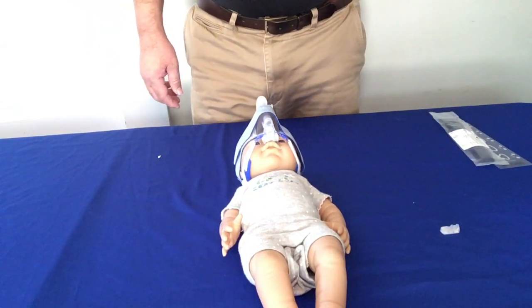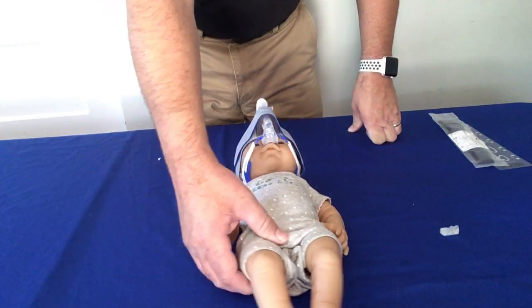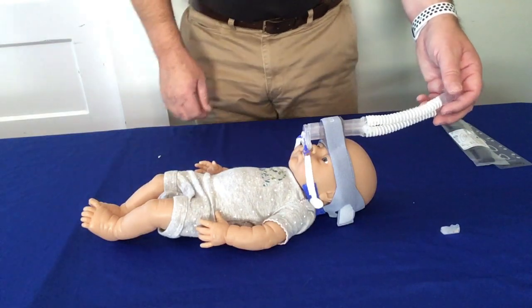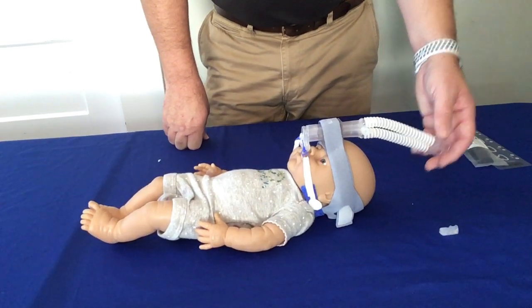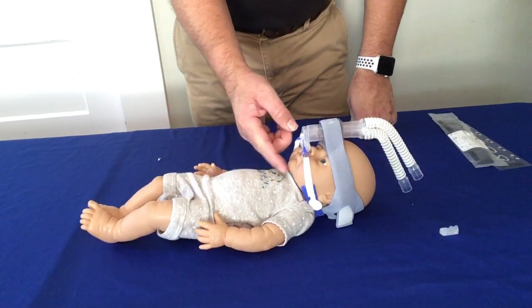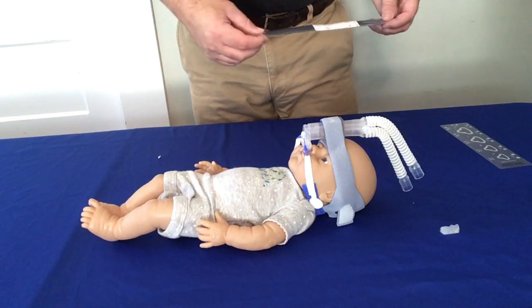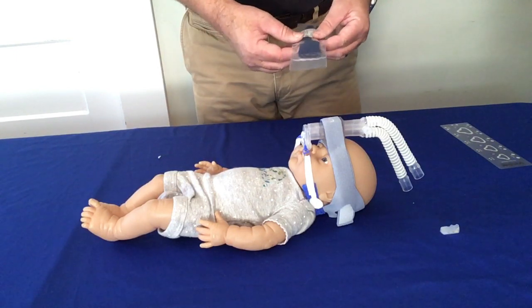If your baby needs a chin strap, it's very easy to determine. The way you do that is if the baby is hooked up to a ventilator or a bubble CPAP and you are getting a lack of pressure reading on either system, whether it's the ventilator or a lack of bubbles in your bubble CPAP, what you'd need to do is go ahead and take your finger and place it under the baby's chin and push up. If you are able to reestablish pressure on the ventilator or see bubbles again on your bubble CPAP, then your baby will need a chin strap. About 30% of kids do need a chin strap.